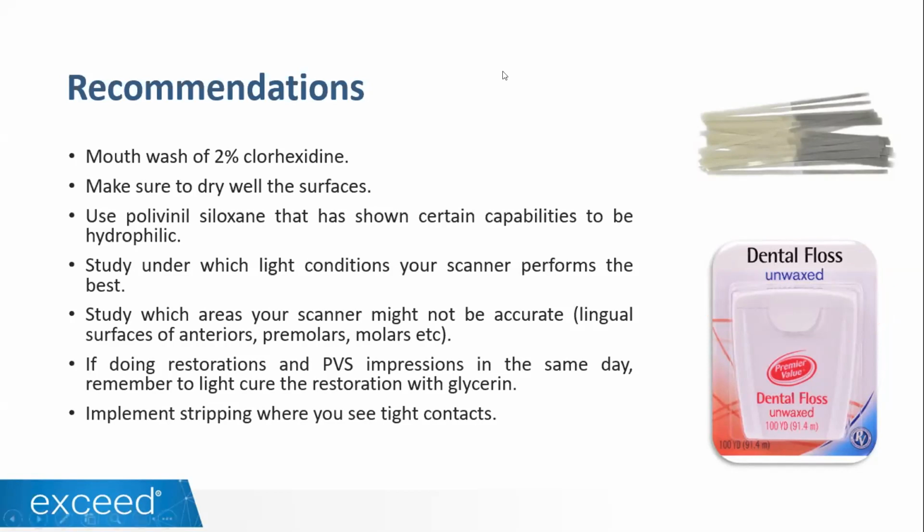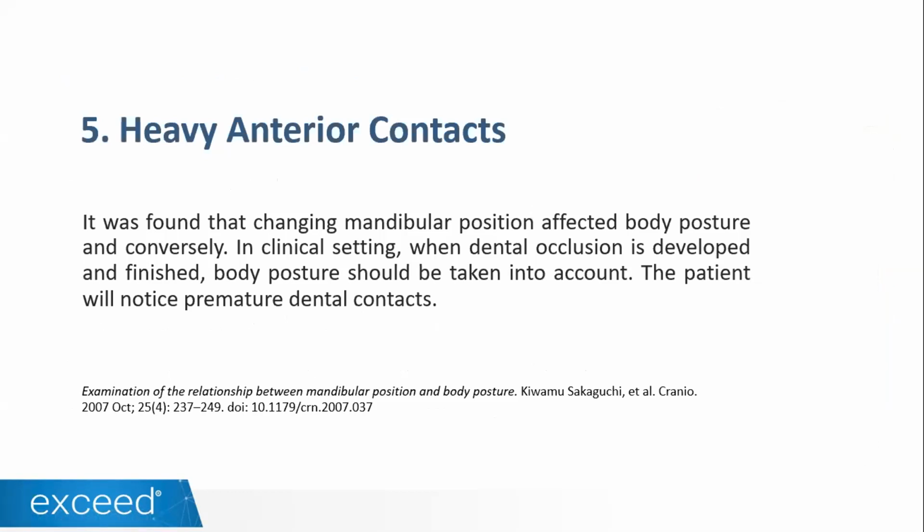So finally, just to end up, and this is something that doctors with a lot of experience can tell you, there are cases where we develop posterior open bites. What I have learned, and this is different from some of my colleagues, is based on what I think has happened and on the research that I have done on why these posterior open bites are happening. For me, they happen because of three things. First of all, you have the aligner in there, the patient is biting in the aligner. So those posterior teeth sometimes get intruded a little bit. That is not wrong. You just finish the treatment, and normally those posterior teeth are going to super erupt. This, for me, is no issue.